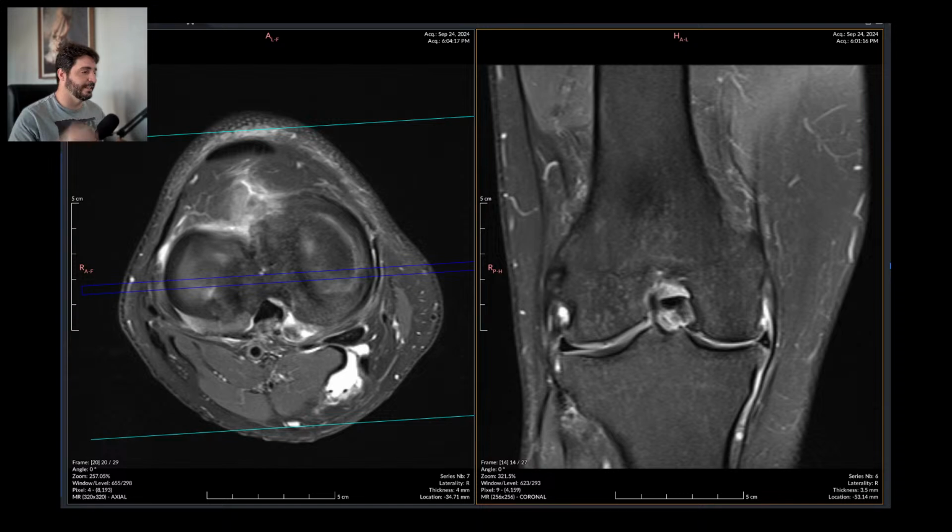Yes, you did. You did, Tim. It's pretty messed up. Even on the X-ray, right? And you also told me that he had a knee replacement surgery on the other side, right?